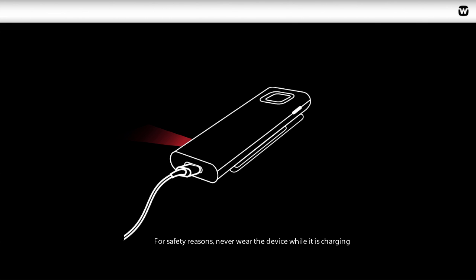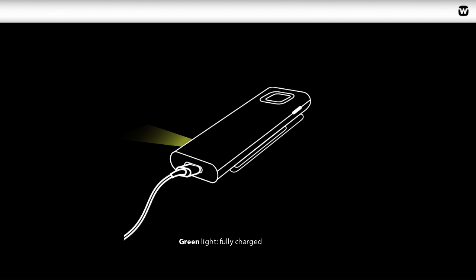And for safety reasons, you should never wear the device while it is charging. Green shows it is fully charged.